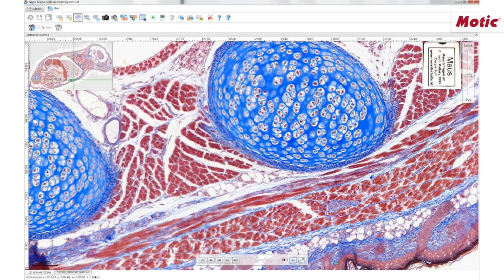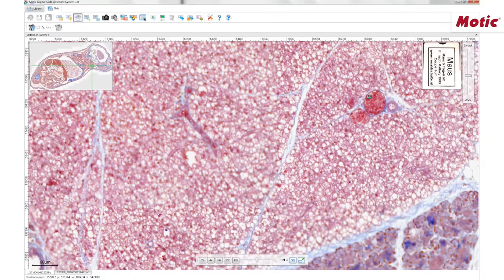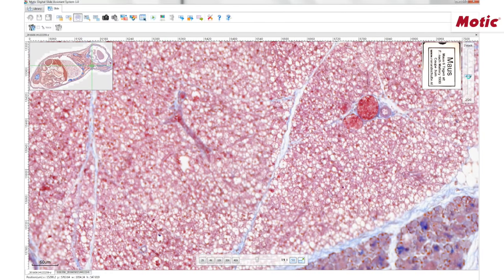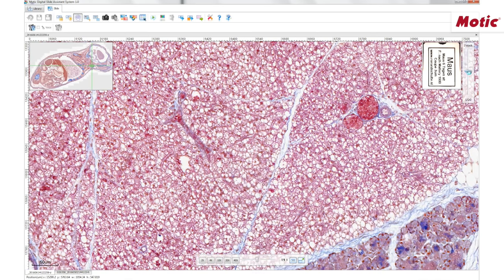On the Z-Stack files, the user has the option to navigate to the different layers of the image. For instance, if I now change the area, I can go through the different layers in order to find the focus for that position.